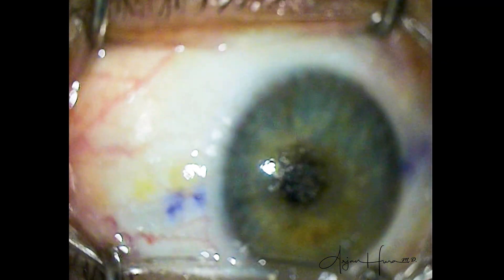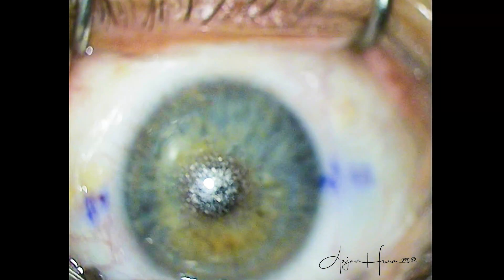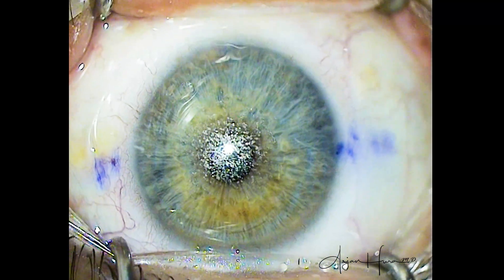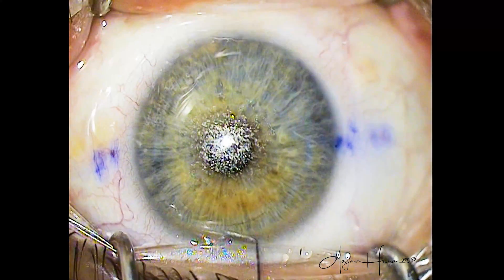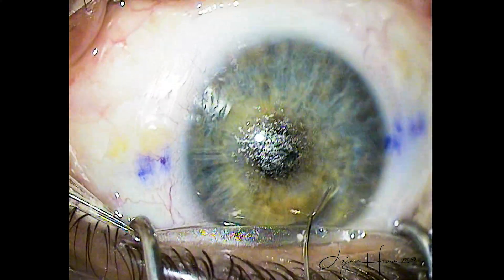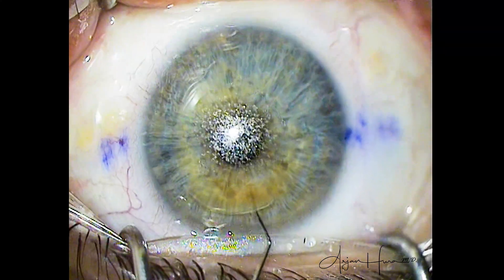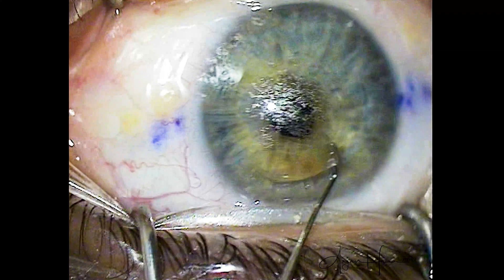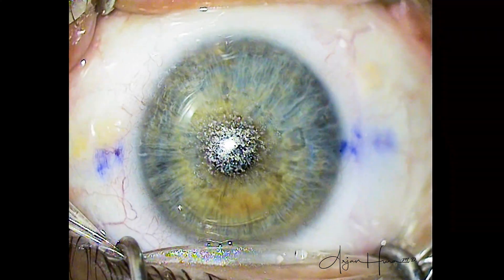We move to the second eye here, taping the eyelids and lashes out of the way. You can see we have good draping covering the meibomian gland orifices and all eyelashes taped out of the way. The eyelid speculum is being inserted, and we will now proceed with the second SMILE dissection. Something you may have noticed is I'm not fixating the eye — that is, I'm not using one hand to grasp at the limbus, conjunctiva, or sclera to hold the eye in primary position. I'm just using the dissector to complete the entire dissection. I would say I'm in the minority of surgeons who does it this way; the majority prefer to fixate the eye.